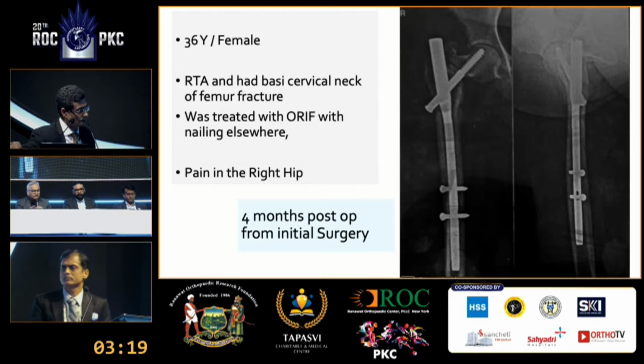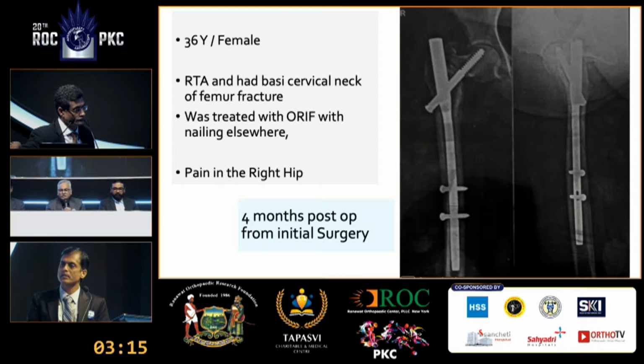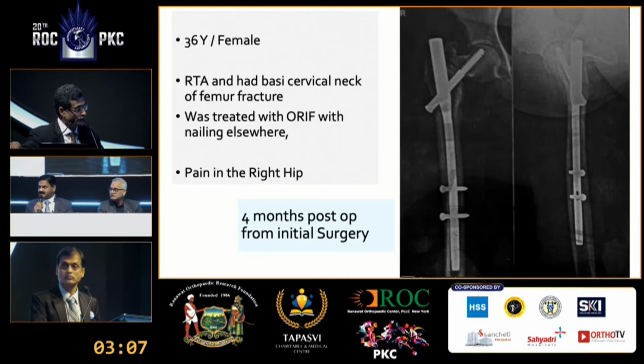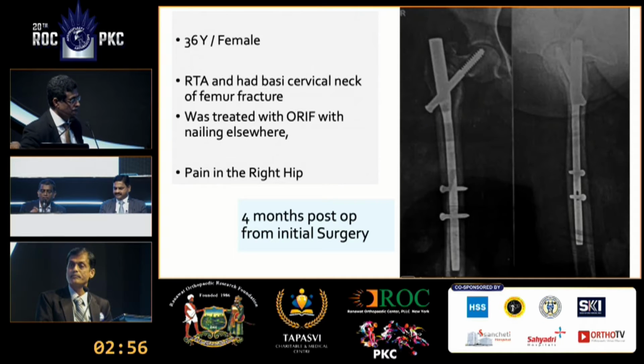There are subtle signs of infection with a lot of lysis around the screws, the lower screws showing some lysis. I will be ruling out infection strongly first, maybe 2-stage. Single stage. Be quick because we don't have much time. Distal fitting stem total hip replacement, single stage, ruling out the infection. Vijay? Infection has to be ruled out, but strictly not a distal fitting stem.